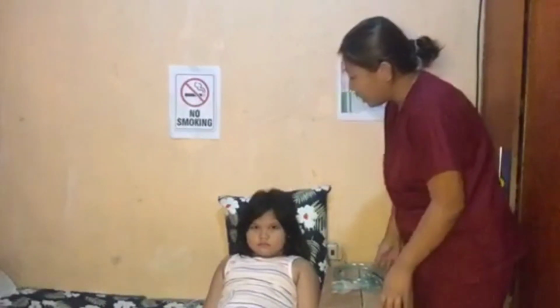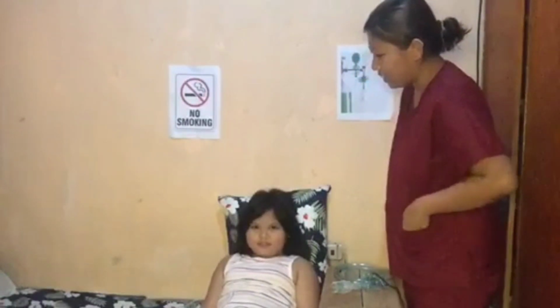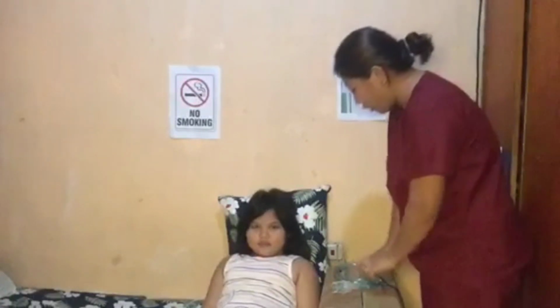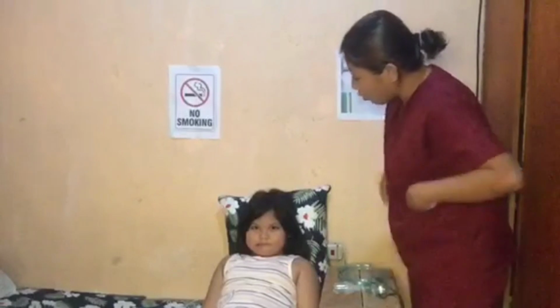Hi, may I know your name and date of birth? Anika Faye Arlelo. Okay, Miss Anika Faye. Today, I am going to administer oxygen to you through an oxygen mask. Is it okay for you?